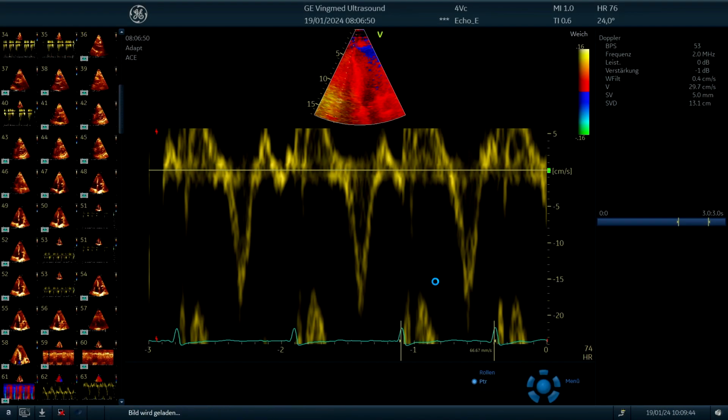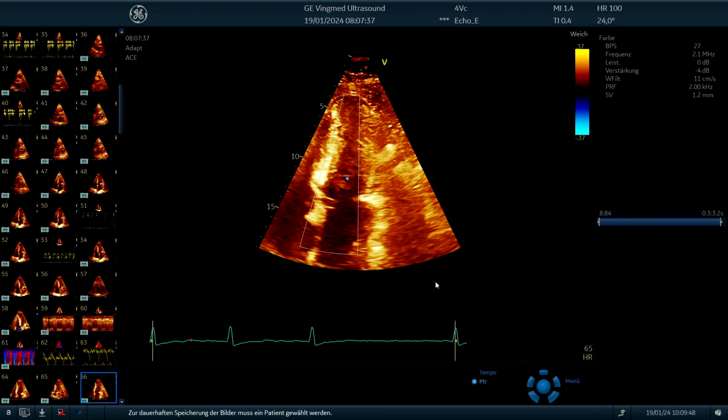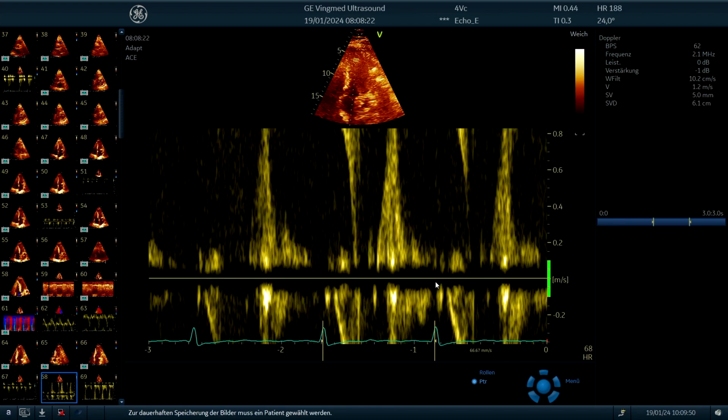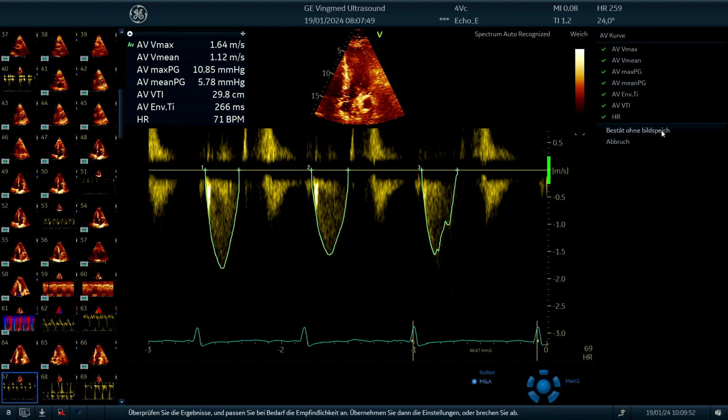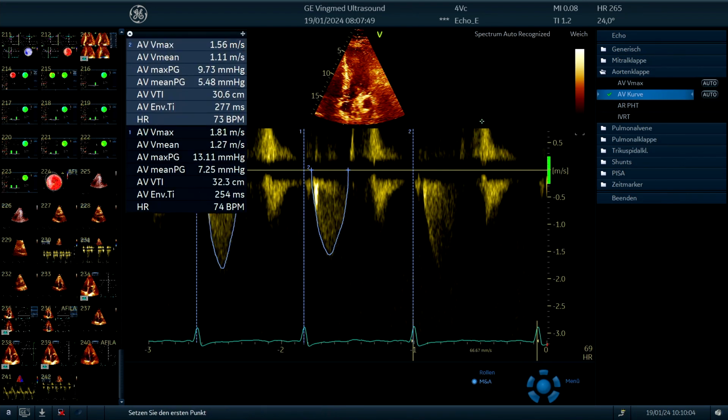We continue the diastolic, we do not need in this case. Here we have the 4-chamber view, we have the 5-chamber view, and we have the various signals. Here we can measure, and it already measures the aortic valve because it's the signal, and both measurements are quite okay. So we are going for those measurements. We save the image and we take those measurements because they are definitely not bad.